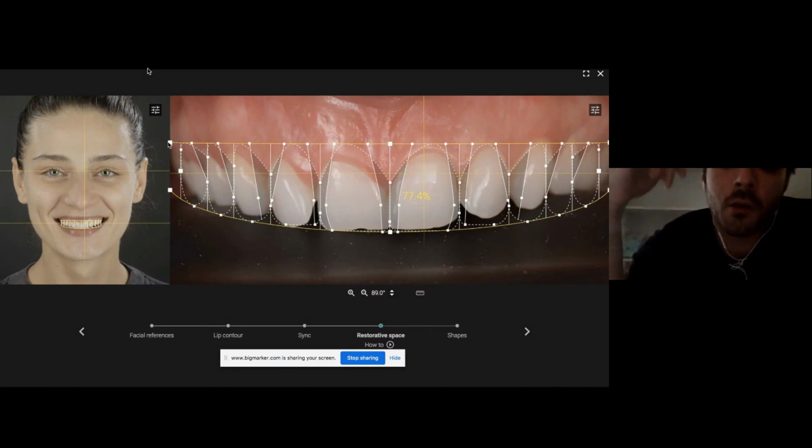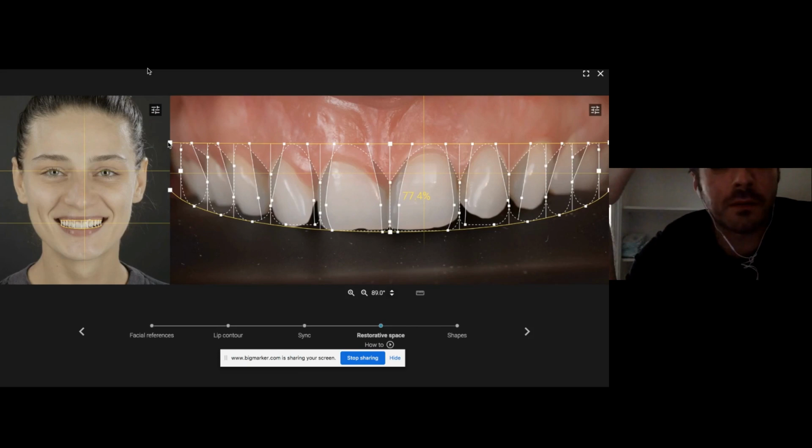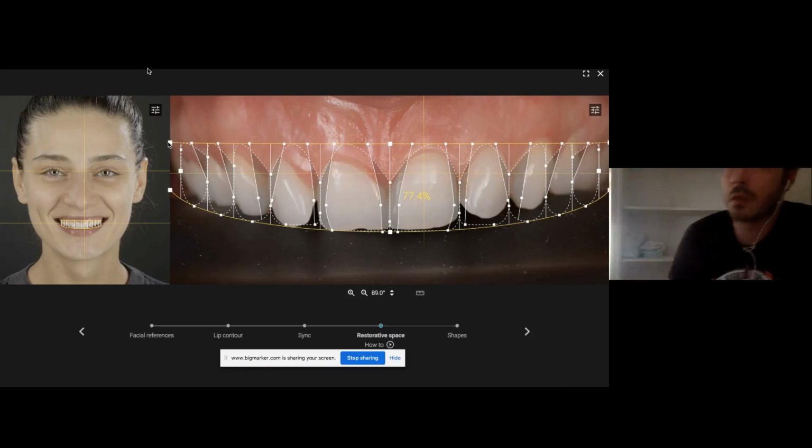Okay. So the idea here is very simple. What we do in a smile design process, what we aim to do is to select, again, those 10 or 12 teeth shapes and relate them to the face. That is what you're gonna do in the first step. You do that in the first step because you just need to communicate with the patient to understand if he or she is willing to do the process, and only after you get the consent you go to the next steps of integrating that and actually planning or executing procedures.